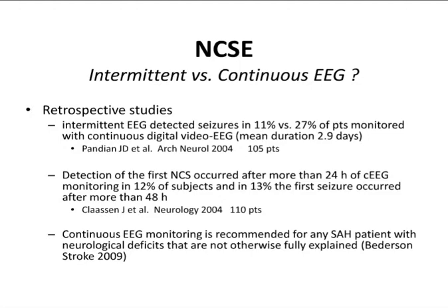Then, of course, it depends on the availability of EEG. But since we know that non-convulsive seizures may at least worsen the secondary damage, they can be frequent. On the other hand, if you use a one-size-fits-all strategy and you have generalized anti-epileptic therapy, it can even harm the patient. So there is a rationale for using continuous EEG monitoring in these patients.